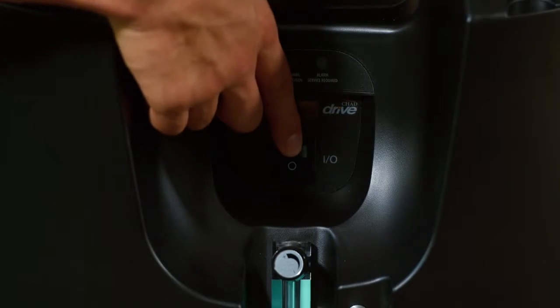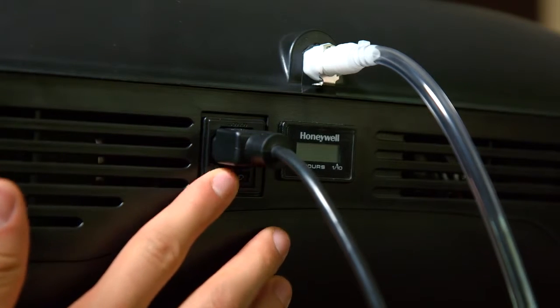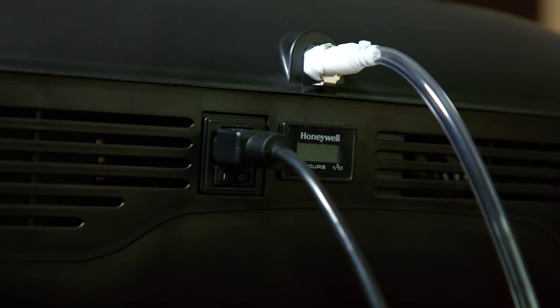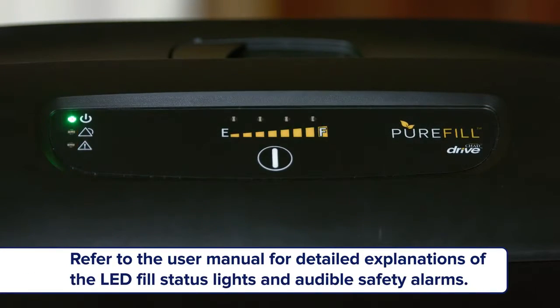Let's go through the filling process. First, ensure that your Pure Oxygen Concentrator is turned on, and verify that the green LED light is lit, indicating normal operation. Next, turn on the PureFill. You will hear an audible tweet, and all the LED lights will illuminate. After a couple of seconds, just the power LED light will remain on.